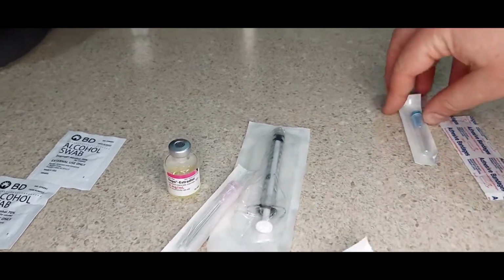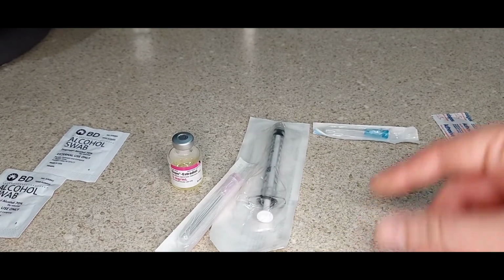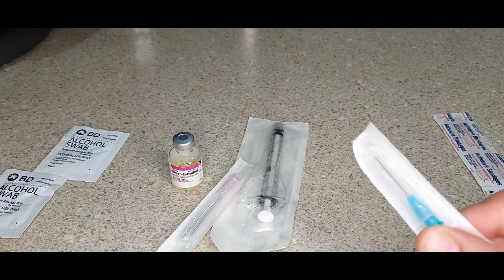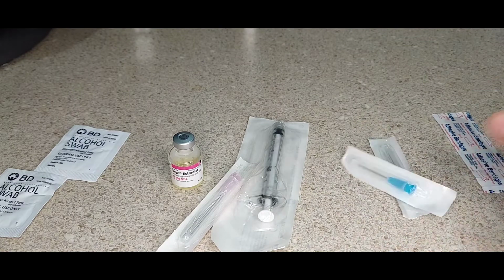So with that in mind, rather than using the 23 gauge, which is rather bigger, I was able to get them to give me 25 gauges, which are much smaller. So I barely even feel these things going in. So with that, that's the explanation. I'm going to go ahead and cut here, and then I will walk you through it.